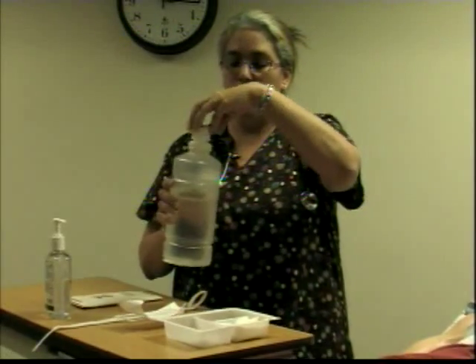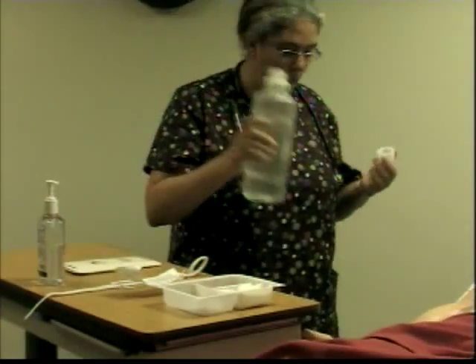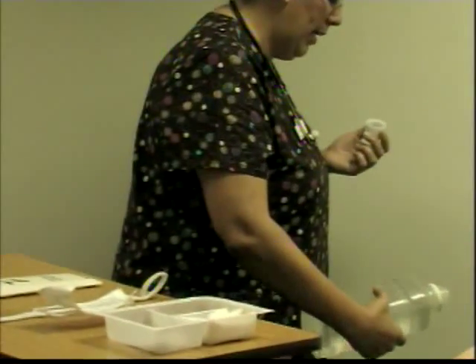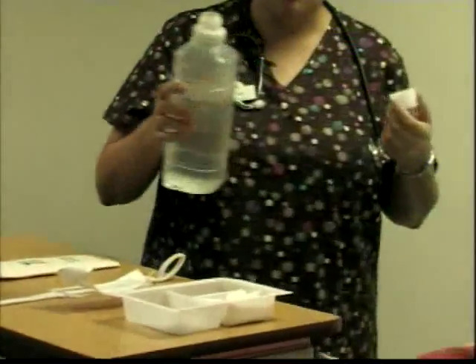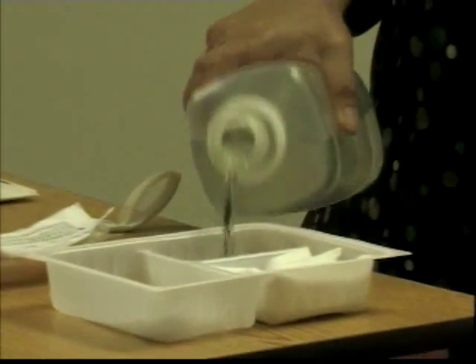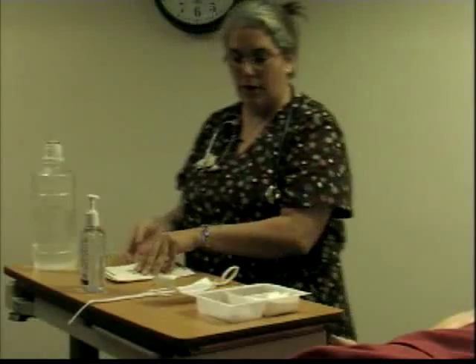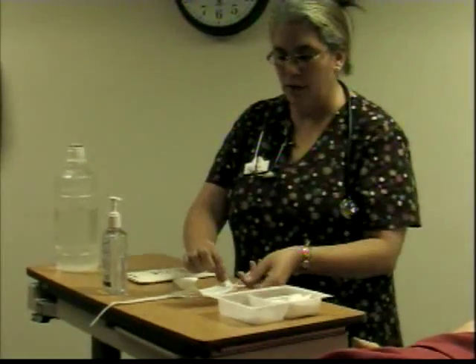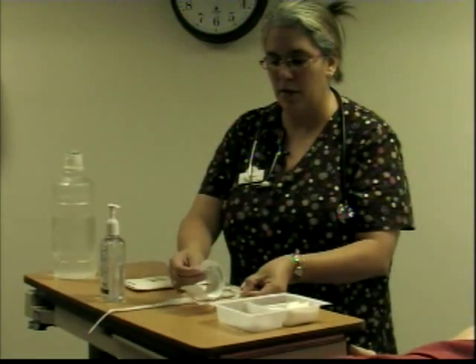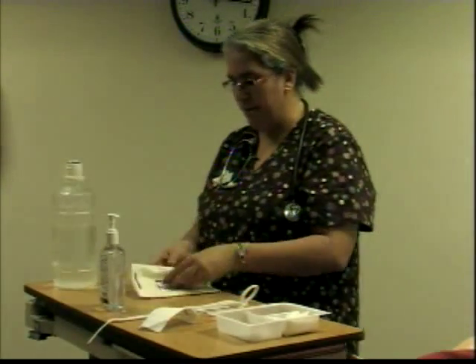So I'm going to pour my saline. This one is already open, so I'll come back over here and lip it and clean it. And I'm just coming in and going to pour my saline into my reservoir. And I'm just going to step back and replace the cap. And I'm going to put my gloves on. I'm ready to go. This one is going to be open already because this is the first thing I'm going to do. So I'm just going to open this, available to me.